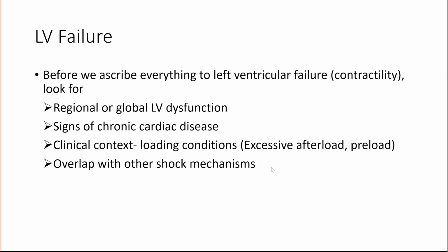Other shock mechanisms can impact it. Sepsis can cause you to be vasodilated, so the heart will appear to be functioning normally. However, it may not be functioning to the extent that is needed for the amount of vasodilation or shock. So you have to be aware of all those things. And also, now this is more important for adults, is the regional wall motion abnormality, so regional or global LV dysfunction.